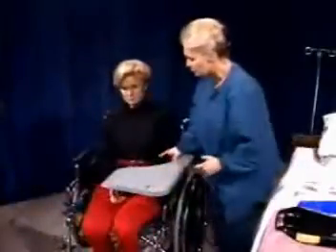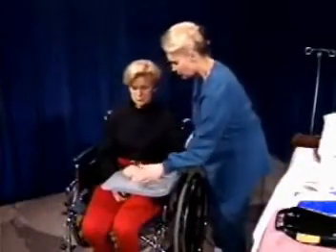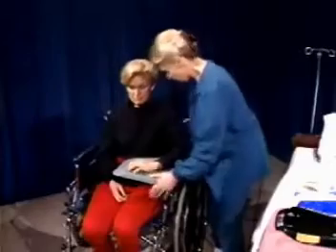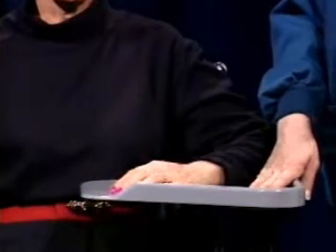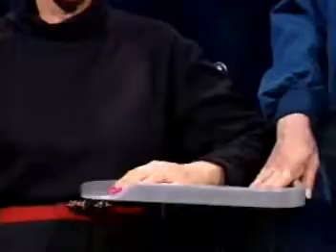And it's used to position the patient's upper extremity. It also helps increase their trunk control somewhat too. This is used primarily with a patient that has sustained a stroke and has no functional use. That means they have no movement of their upper extremity at all. This is an excellent piece of equipment that we use routinely with stroke patients.